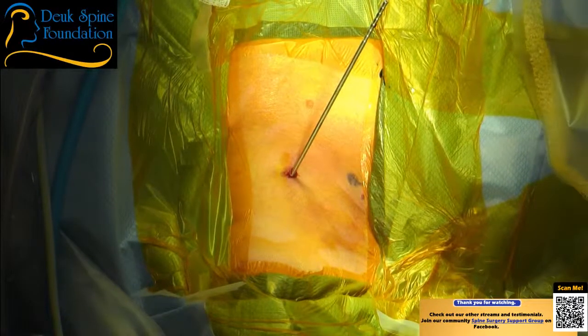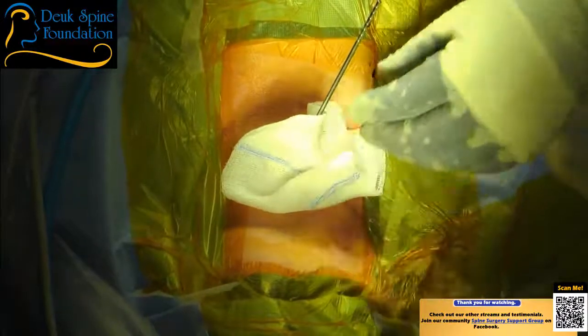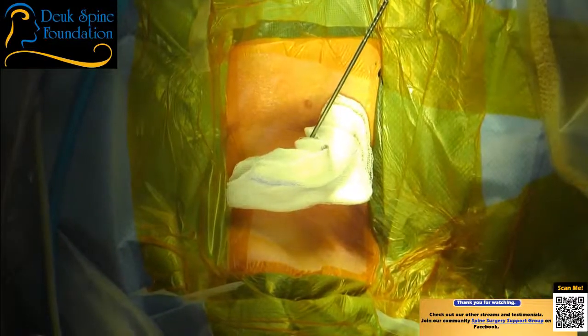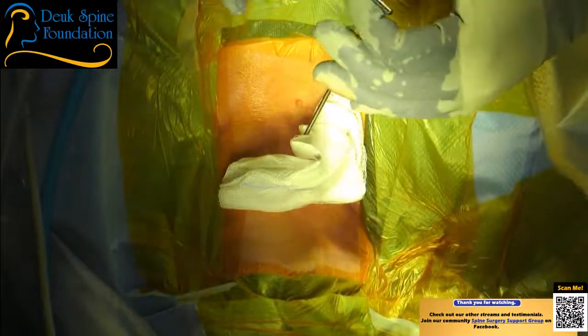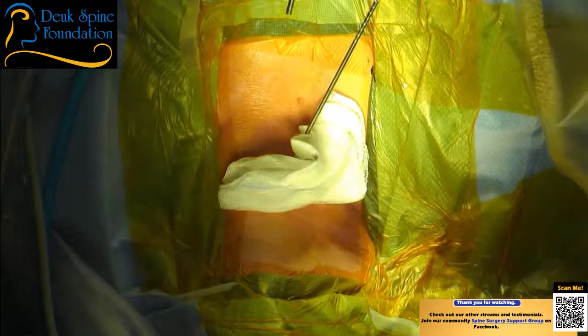Perfect. So I'll only need an x-ray for another minute here while I bring the actual tubular retractor down. So the sequence that I'm doing of steps is the same for every patient. It's needle, guide wire, dilator, and then tubular retractor. The whole surgery will be done through this tube. It's called the tubular retractor. And the way we do this is with the endoscope.